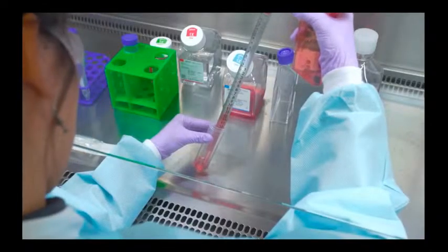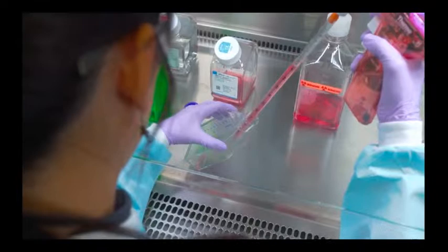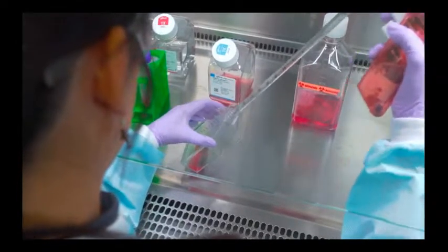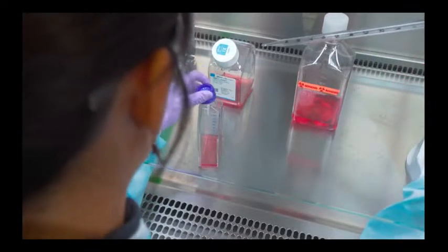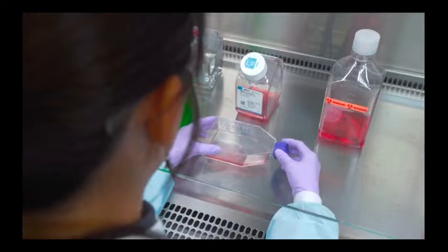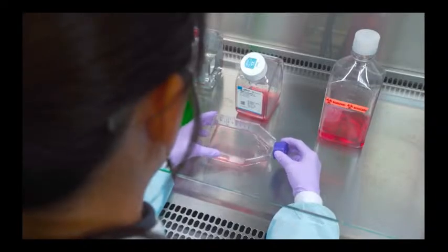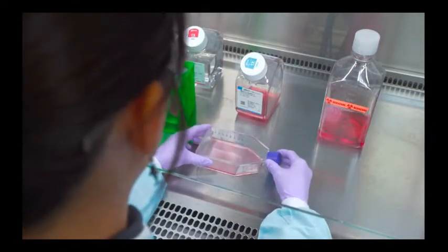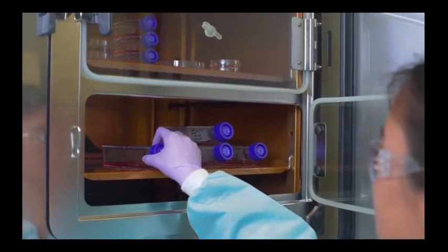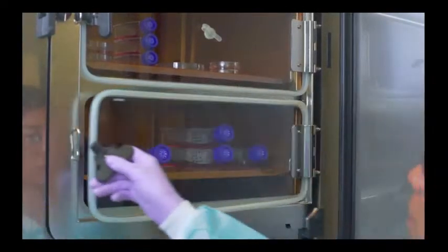Add the required medium, mix the cells gently, and pipette the solution into fresh flasks. Cap the vented caps on your flask tightly. If the caps are not vented, cap loosely. This keeps contamination out while allowing adequate gas exchange. Use a north-south, east-west motion to evenly distribute the cells and transport the flasks to the incubator.